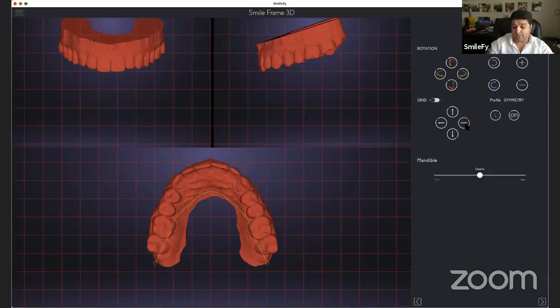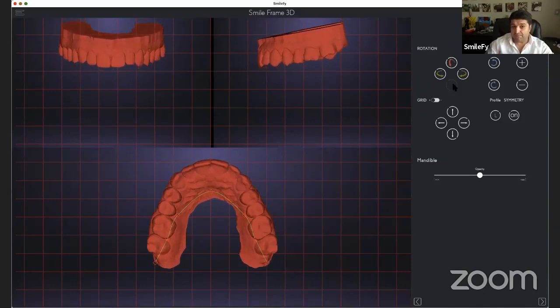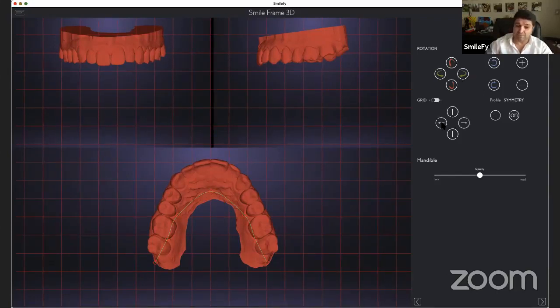Based on our research, 50% of the patients don't come back if you don't offer them a nice idea of the treatment planning in the first appointment. So we try to keep the patient in the first appointment and to deliver as much information as possible about the aesthetic treatment, so that the patient understands emotionally the improvement.